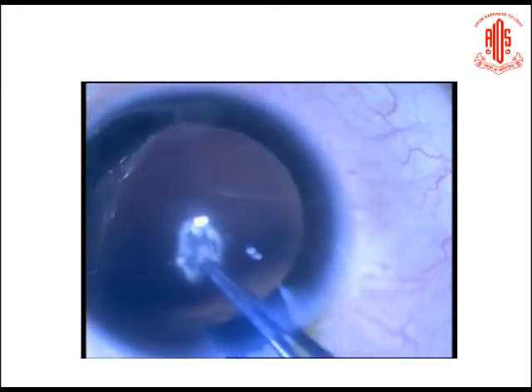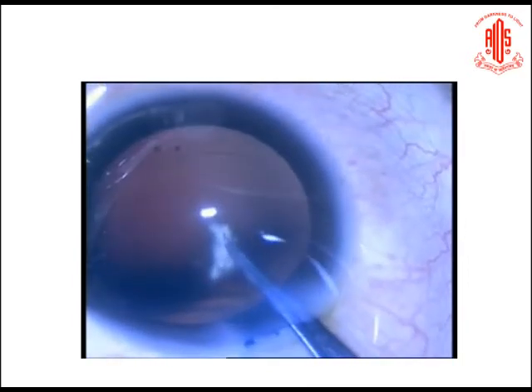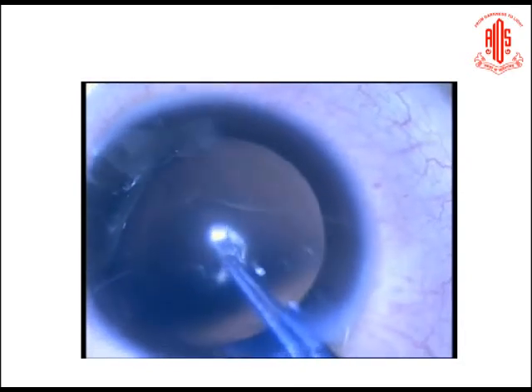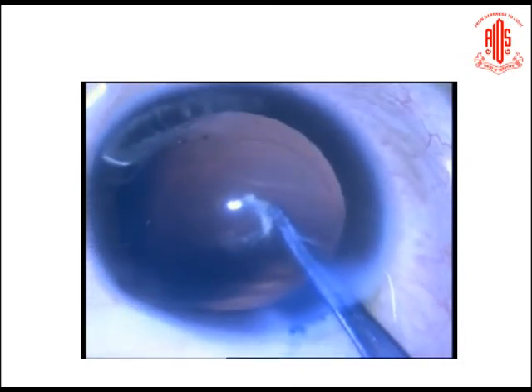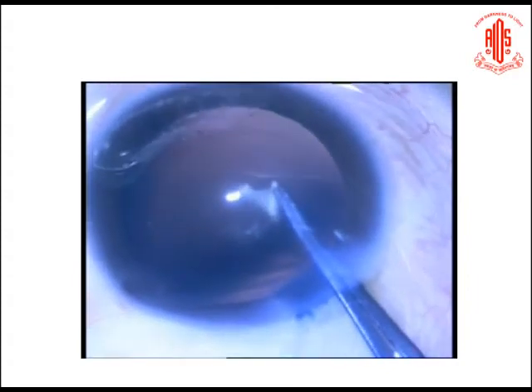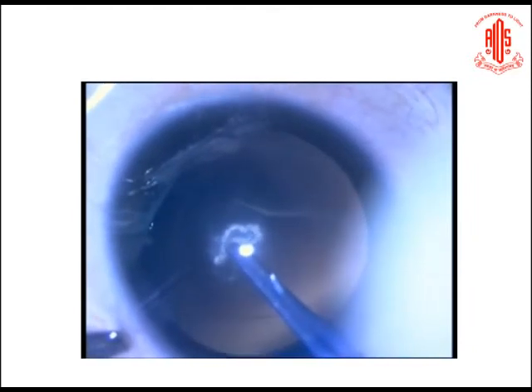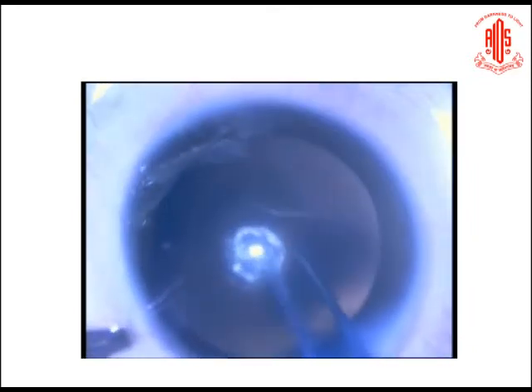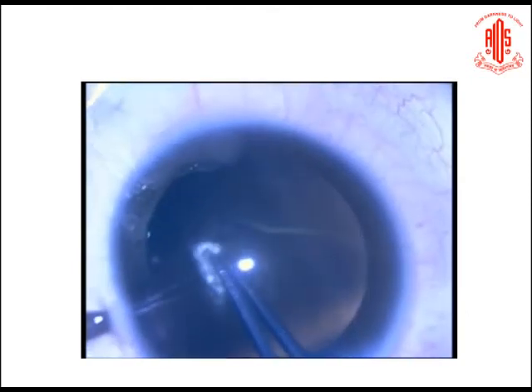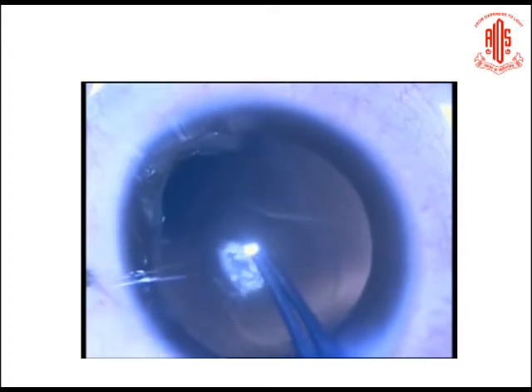Then we do encounter these cases of posterior plaques with posterior lenticonus or a more prominent anterior hyaloid. In these cases, life becomes much easier. Once you've made a nick around the plaque, you can easily grab it and shear it off, because you have a nicely formed vitreous behind it. So capsular access in these cases is the easiest. You can just nudge it from all the sides after making one nick, and finally grab it and pull it out.